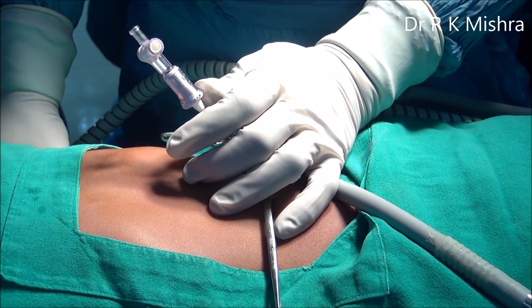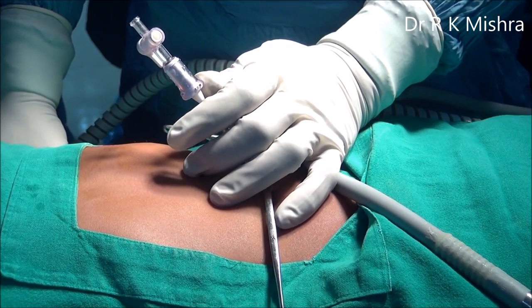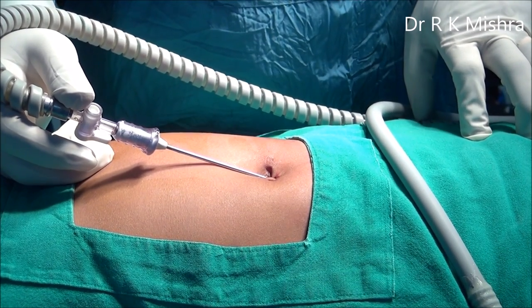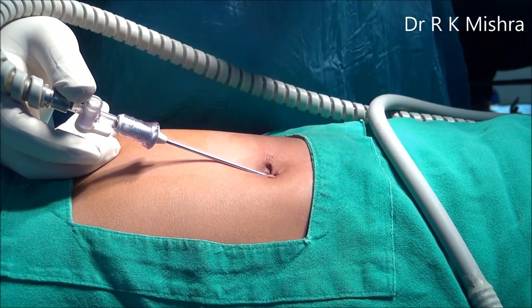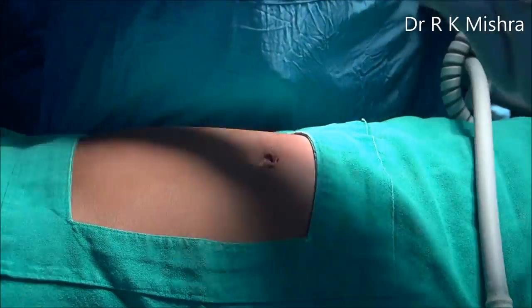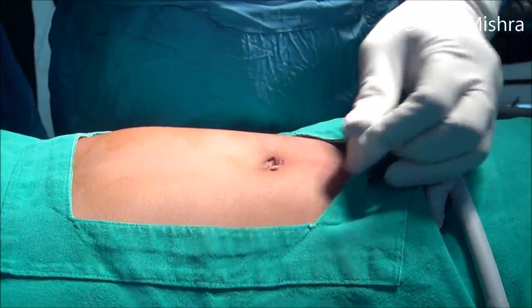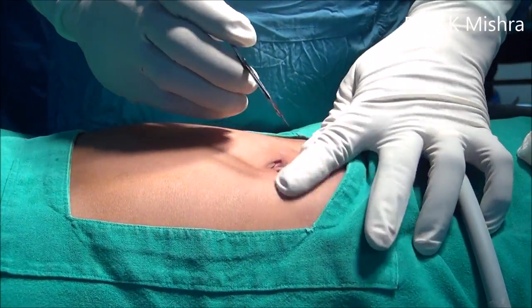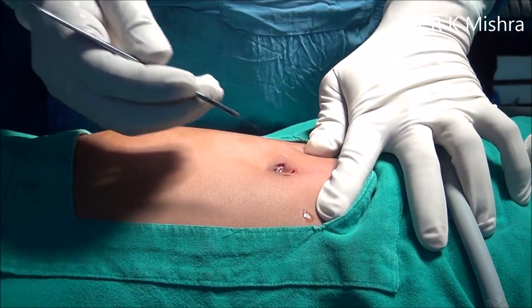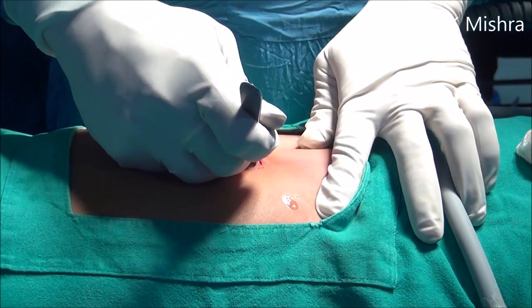After confirming correct placement, attach the insufflation. In pediatric patients, the preset pressure should be 8 mmHg and the flow rate should be 0.1 liter per minute per year of age. In this case, just 800 ml of gas is infused, after which it is increased.